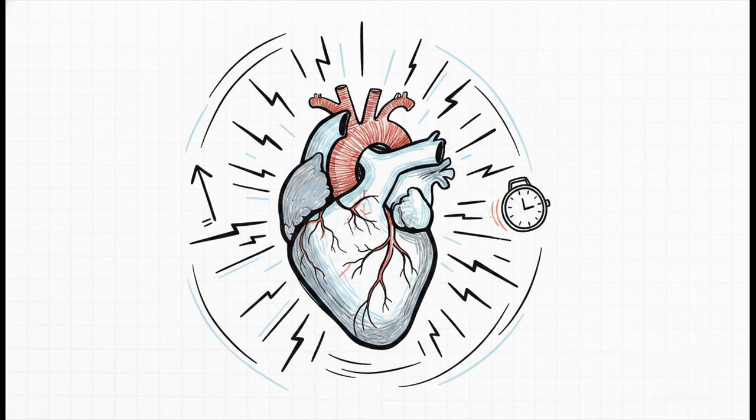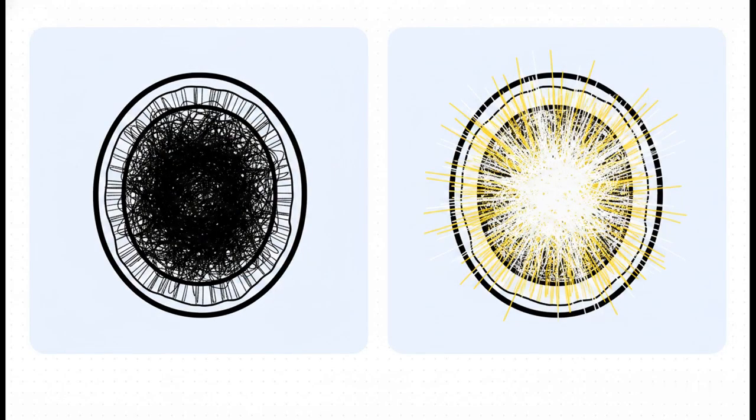Cardiac MRI. The heart is literally always beating, which means speed is everything here. When we compare the two results side by side, spin echo gives us that dark blood signal void because the blood flows away. But on the gradient echo side, we have a specialized sequence called Balanced Steady-State-Free Precession, or BSSFP.